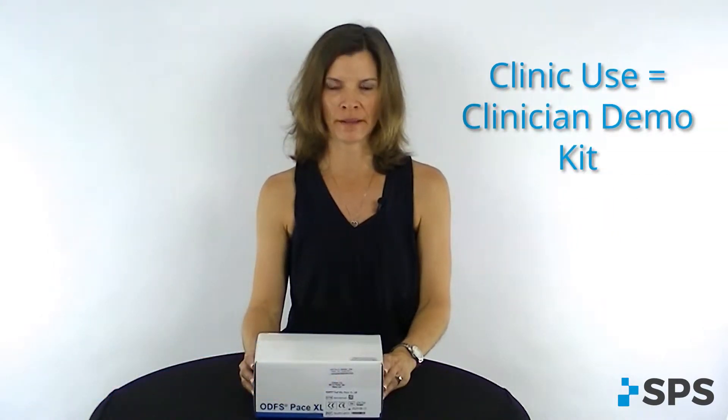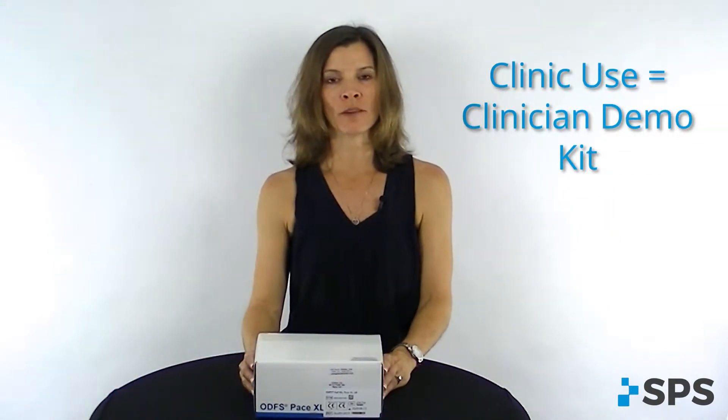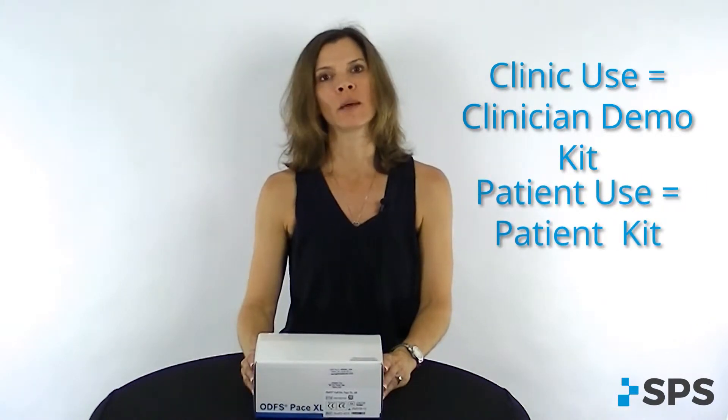Welcome to the PaceXL training video. I'm Jodi Brzezinski. When ordering equipment for use in your clinic, you'll be ordering the clinician demo kits. When ordering equipment for patient use, you'll be ordering the patient kit. Both sets of equipment have exactly the same contents, and I'm going to take you through the boxes so that you know what's in those kits.